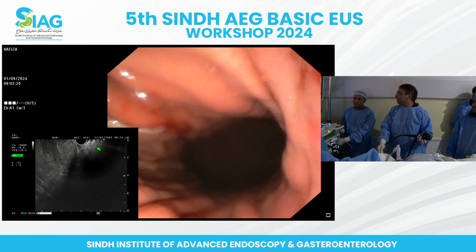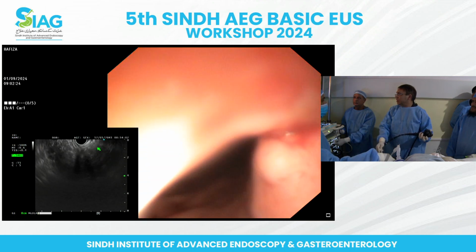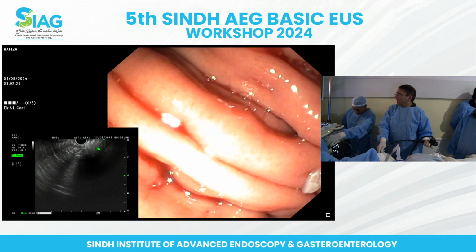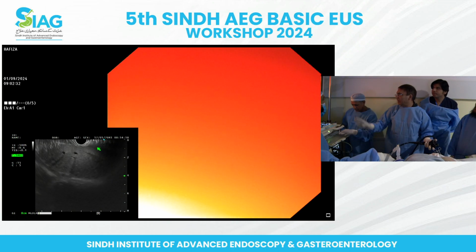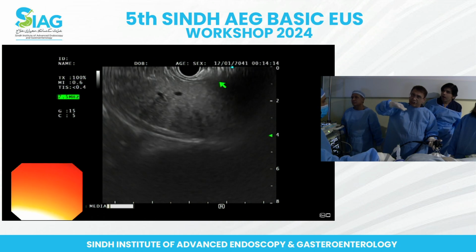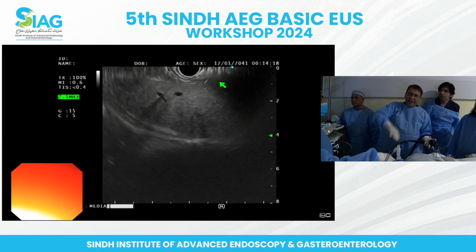It's just FNA. So here the way I always tell is, from the GE junction, go towards the opposite wall of the stomach, and then you use the suction. That would take you to the left lobe of the liver, basically segments 2 and 3.